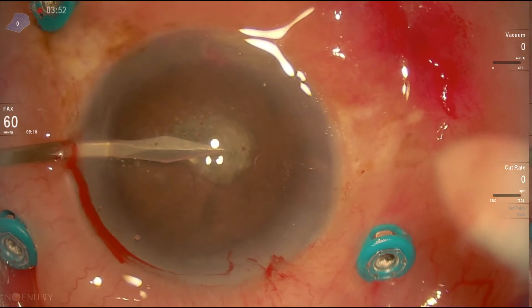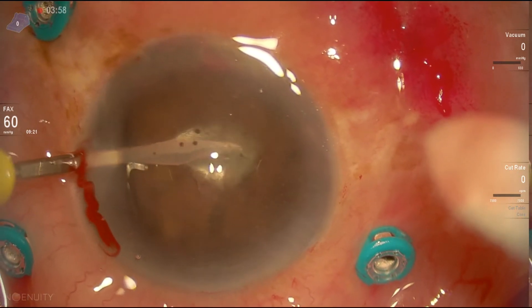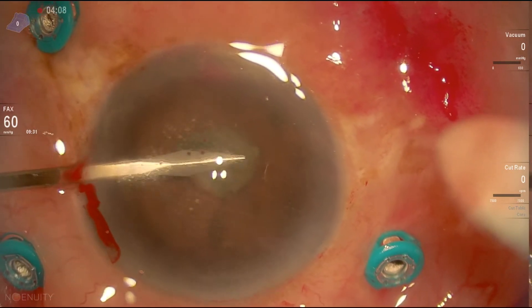We'll continue that from the other side. At this stage, we're trying to avoid putting fluid inside the eye or viscoelastic, because we would like to do a vitreous biopsy under air and we do not want to dilute the sample.